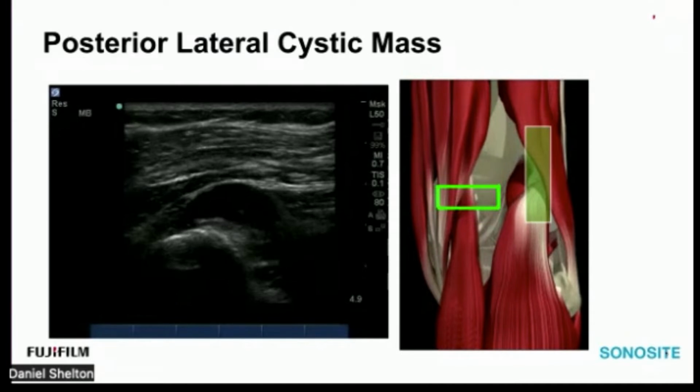Now, if you expect some sort of meniscal pathology back here and you don't see it, don't rule it out. But if you do see a big old meniscal cyst back here, then you're probably right. Ultrasound confirms these meniscal cysts all the time. And once your eye-hand coordination gets under control, you can chase those right down to the area where the tear might be. But in your early phase, this may be a tricky diagnosis. So don't rely on ultrasound to diagnose and rule out meniscal pathology.